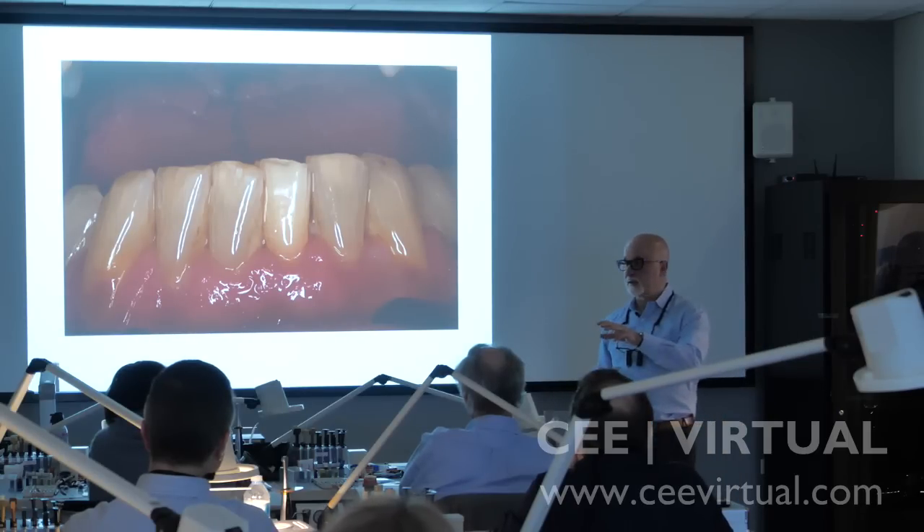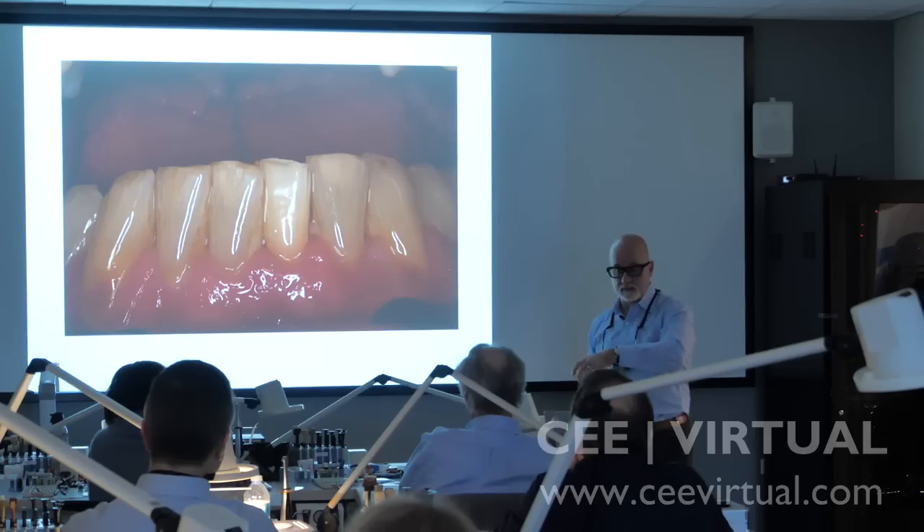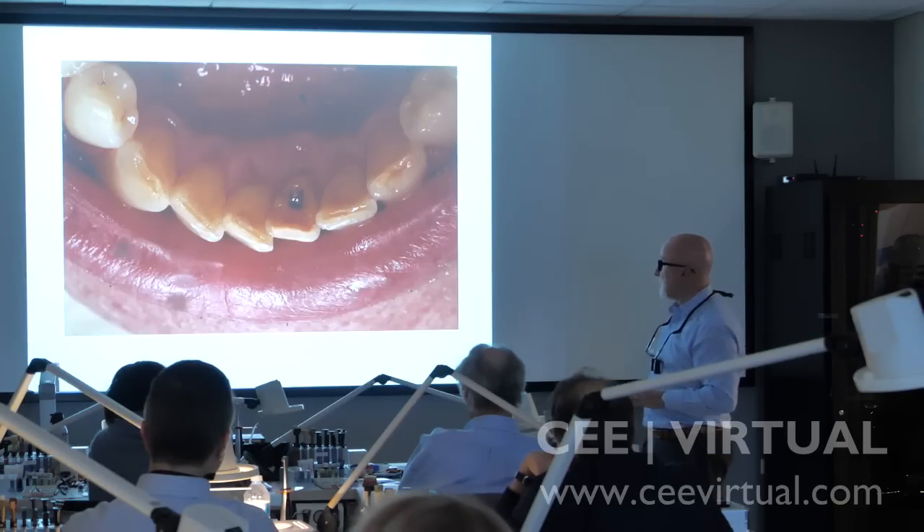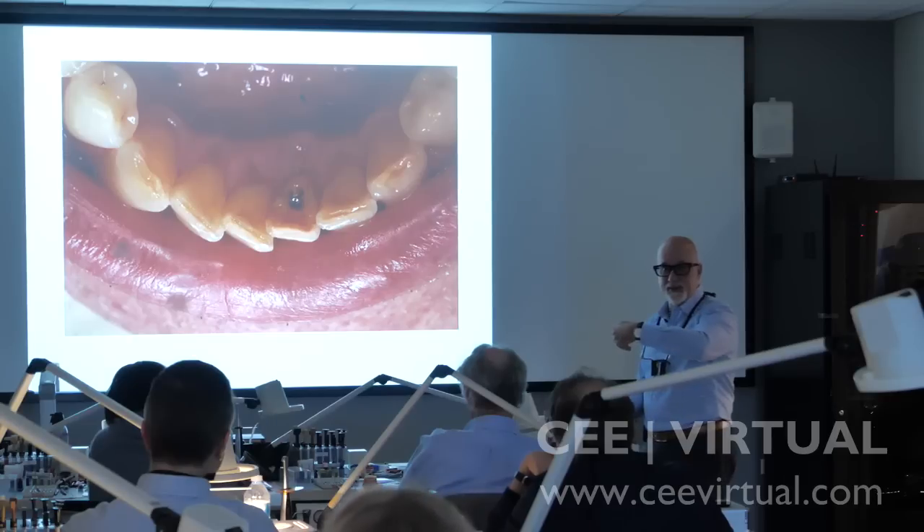Prior to extracting the tooth, I'm going to make an impression. The material I'm going to use is called RSVP Clear PVS. It's a clear polyvinyl, and the reason why I want to use clear is I want to be able to light cure through the clear. I don't want to use a putty or any other type of matrix — I want to use a clear.